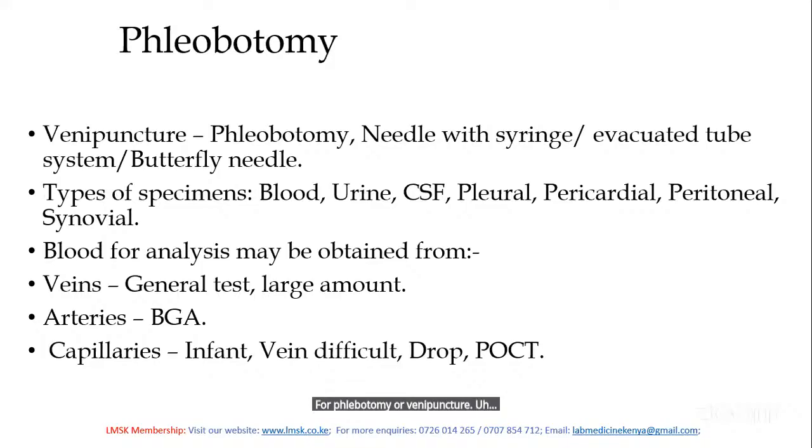You need a needle with the syringe. This combination is the common old model still in use, where you fix a needle to a syringe. It's okay.